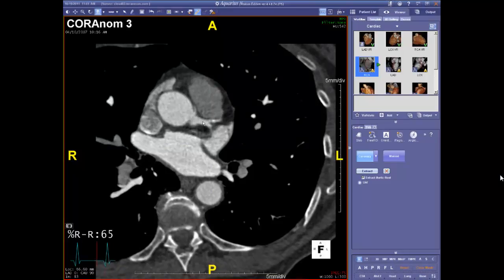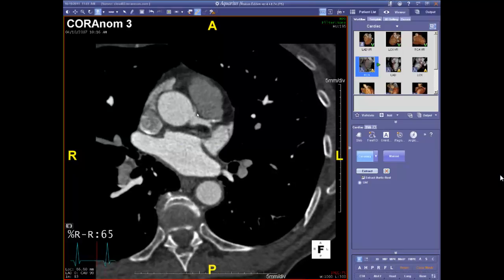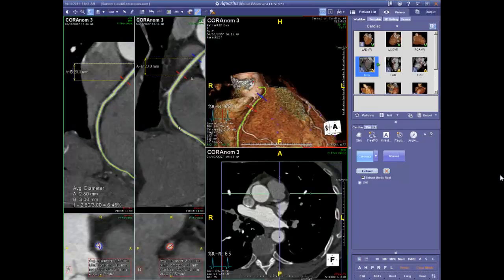We'll bring up some report samples at the next webinar. On the axial view, we're looking obliquely at a vessel so this isn't necessarily the perfect view, and the left main might be a little distorted. What I'd like you to see is this narrow offshoot of a vessel that takes off and runs backward at about 179 degrees. Here's the AV groove on the right; typically the right coronary artery heads right to the sternum, but here it's coming off almost from a common origin with the left main, certainly arising from the left sinus of Valsalva.